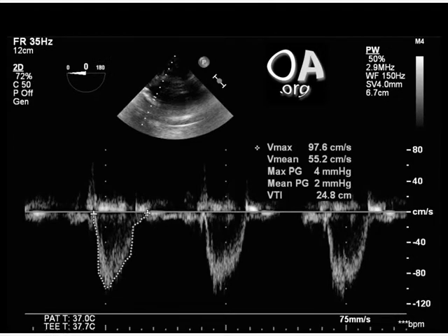This is the VTI at the left ventricular outflow tract, using pulse wave Doppler in the deep transgastric view to obtain the stroke distance. Here, this VTI, or stroke distance, is measured as 24.8 centimeters.